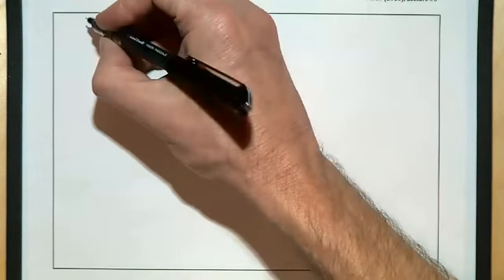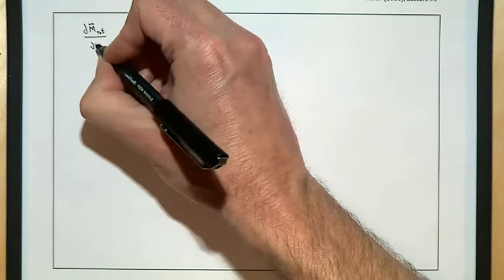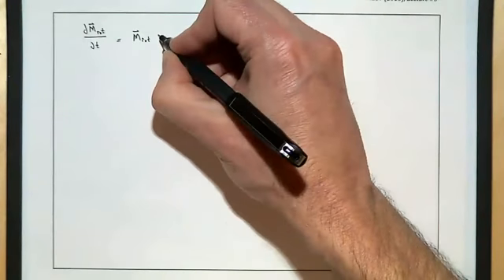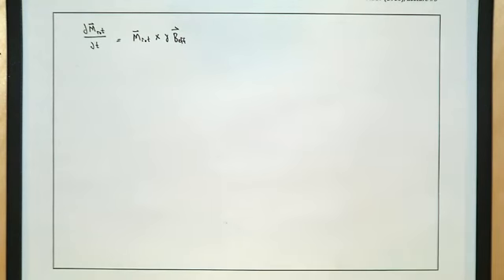Okay. So just continue with this. We defined our B1 envelope function now, the actual RF pulse. Let's go back to the equation of motion in the rotating frame, because we now want to use that actual B1 field. And so we know what that looks like. You guys can maybe hopefully almost write it as quickly as I can. So that is just the equation of motion in the rotating frame.